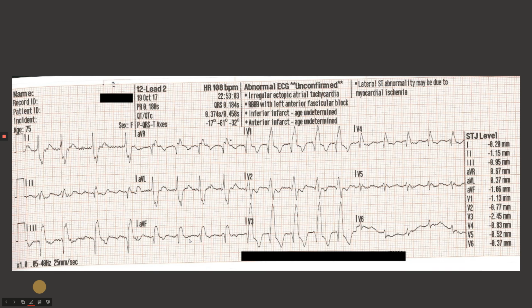If the patient, for example, and we run into this a lot, doesn't have a doctor they go to regularly and they say, yeah, everything's fine, and you see this, this would raise concern. This is like, you should definitely see a doctor at some point soon. But it's not a STEMI, okay?